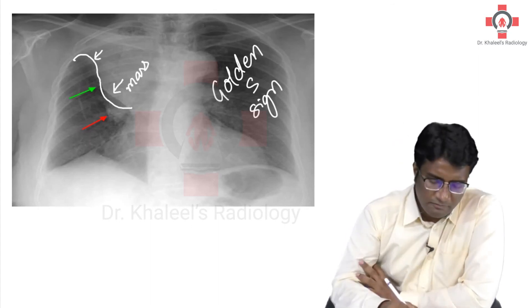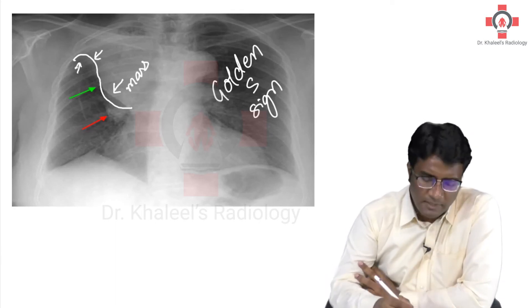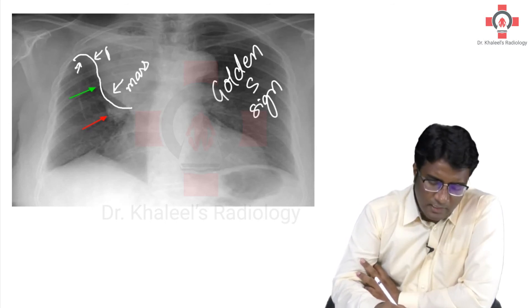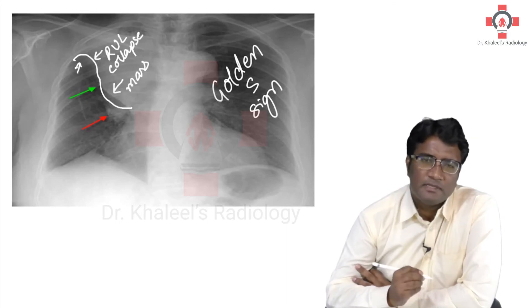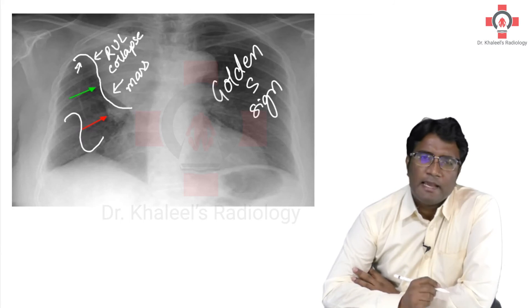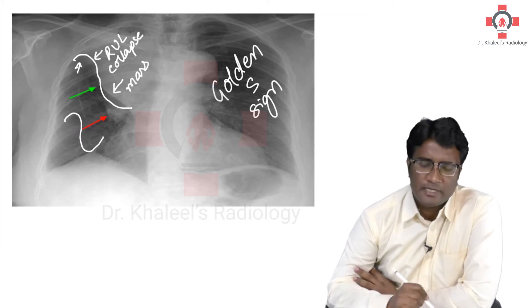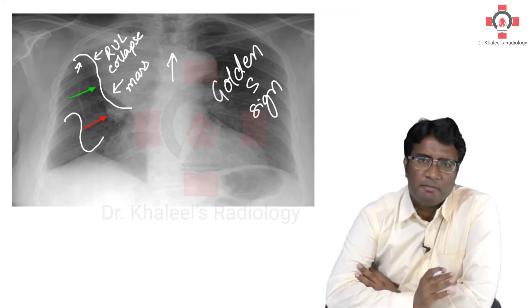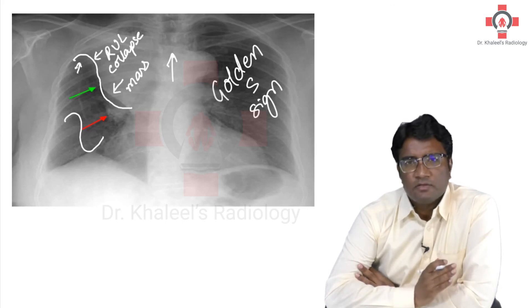The fissure also got lifted up. So you have this concave upward part because of the right upper lobe atelectasis or collapse, and the lower convex part because of the mass. This is a Golden S sign, which is actually a reverse S sign. Had it been only a right upper lobe collapse, the trachea would have shifted to the same side. But as you can see, the trachea is in the midline — the mass is preventing any tracheal shift. So this is the Golden S sign.